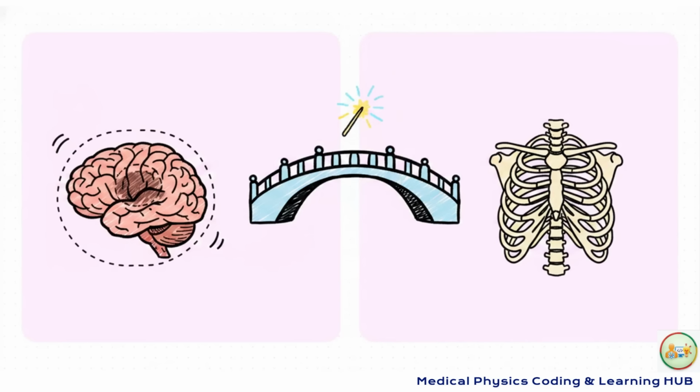Well, here's the catch. MRI gives us beautiful, highly detailed soft tissue contrast. That is absolutely amazing for pinpointing exactly where a tumor is located. But it fundamentally lacks physical density information. CT scans, on the other hand, provide electron density and Hounsfield units, which actually measure that physical tissue density. We literally need those metrics for accurate dose calculations in radiotherapy. You just can't safely plan a radiation treatment without them. So synthetic CT steps in as the ultimate bridge, using AI to predict those CT values straight from the MRI scan.